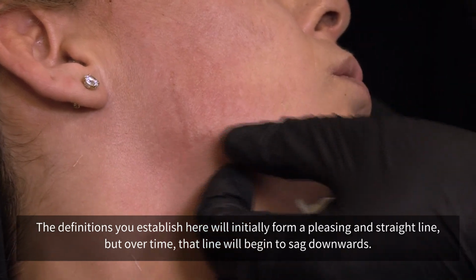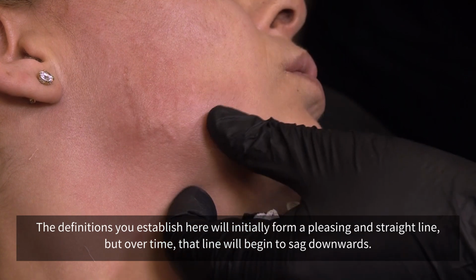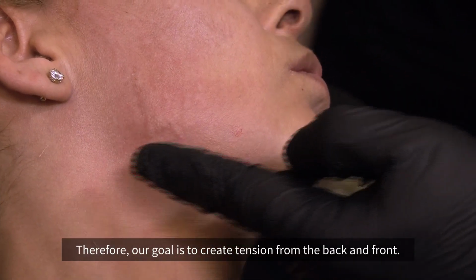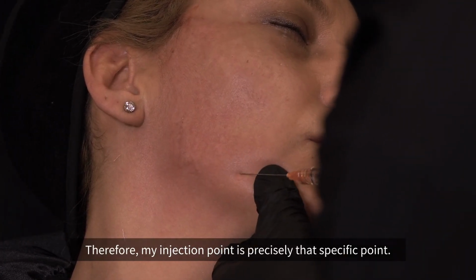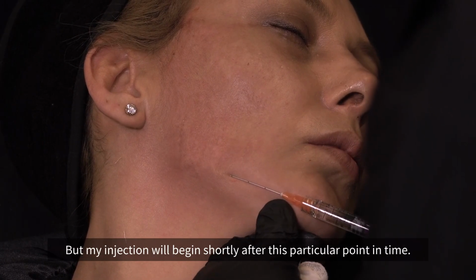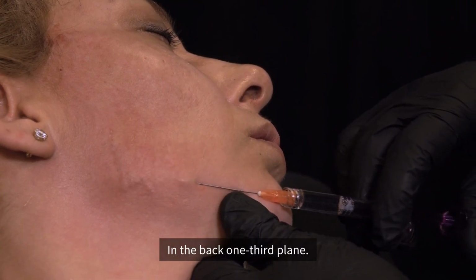The definitions you establish here will initially form a pleasing and straight line, but over time that line will begin to sag downwards. Therefore, our goal is to create tension from the back and front. Therefore, my injection point is precisely that specific point. However, the specific entry point for the injection is here. But my injection will begin shortly after this particular point, in the back 1/3 plane.